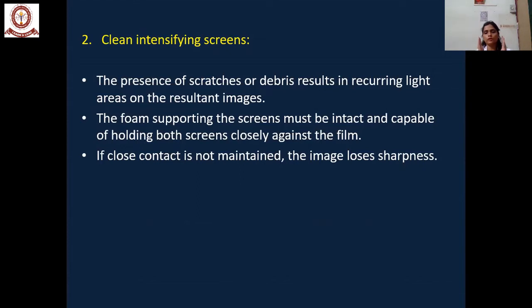The foam supporting the screens in the OPG cassettes must be intact and capable of holding both screens closely against the film. If close contact is not maintained within the OPG cassette, the image might lose sharpness. So we should make sure about the supporting foams and the close contact of the film to the intensifying screens.